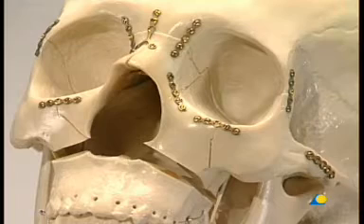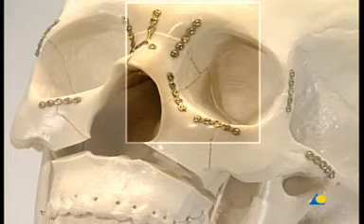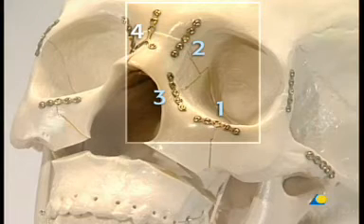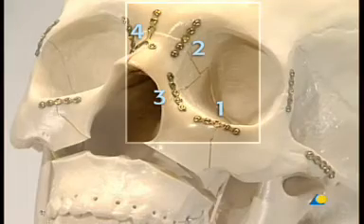The reconstruction of the left orbital rim starts with anatomical realignment of the fractures. 1.3 plates are placed at the inferior orbital rim, the nasofrontal fracture, and the nasomaxillary process. An inverted 1.3 Y plate is used for further reduction and stability of the nasal skeleton.